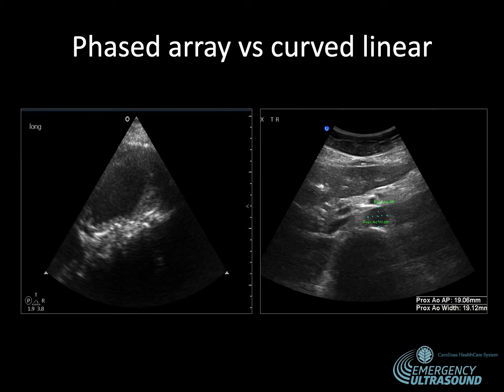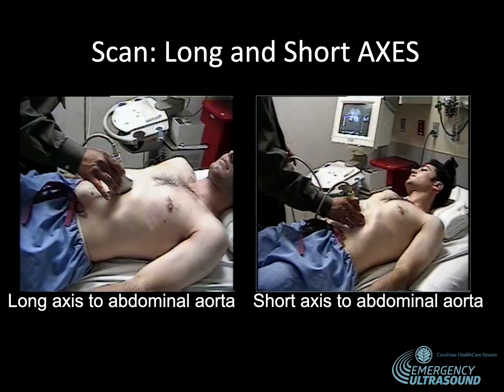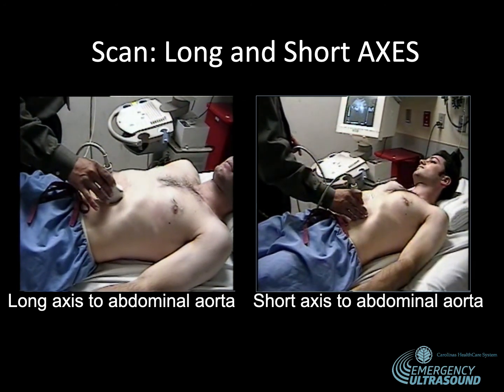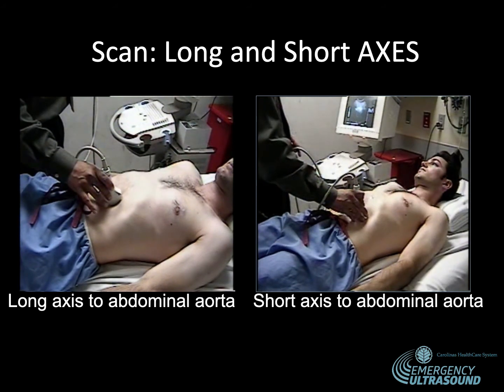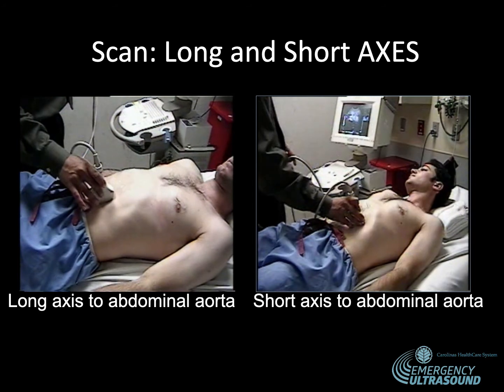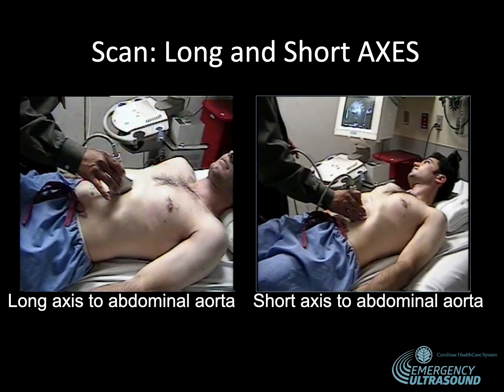My preference is obviously the curvilinear probe, which you might have noticed with a lot of exams. It gives a much better view, and if you look at the image on the right, we can see the abdominal aorta, we can see the vertebral body with shadowing beneath it, giving you that nice Mickey Mouse view that you want to see. So in order to scan, we want to scan both the long axis of the abdominal aorta and the short axis of the abdominal aorta, looking for any changes in the vessel lumen, any dilation, anything in the vessel itself.